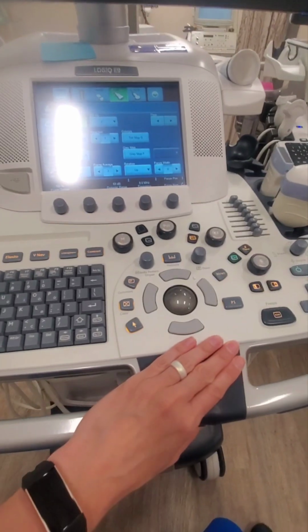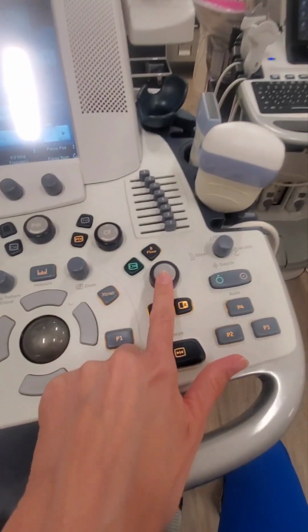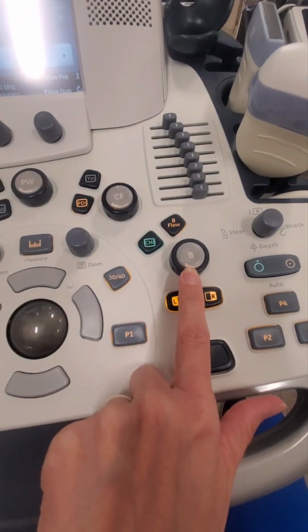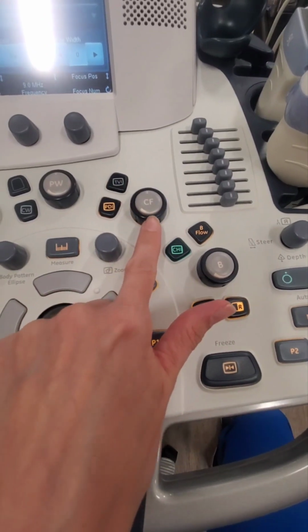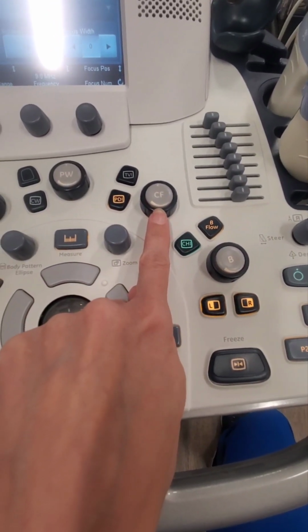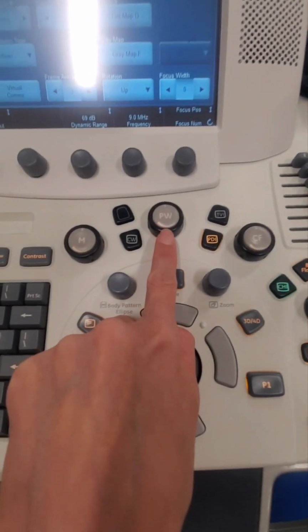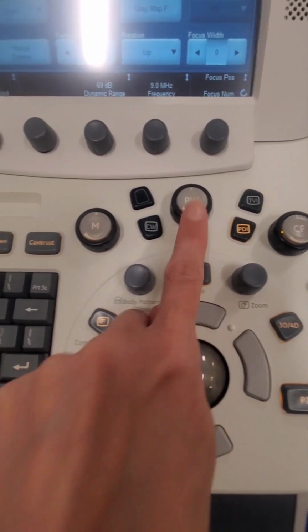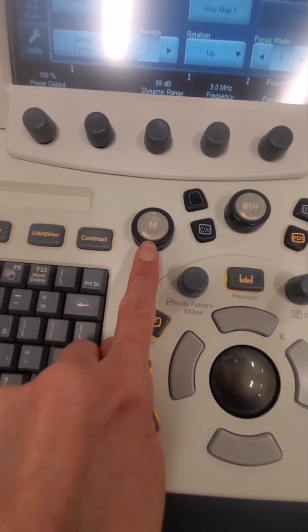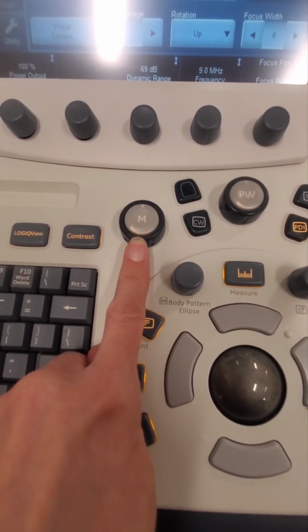All right, so we scan in different modalities. We have our B mode. This is our basic grayscale. We have color flow, which is a Doppler technology. It's a scanning modality. We have pulse wave, which is another Doppler technology. It does spectral. We have M mode, which is really good for motion. I'm going to demonstrate these for you as well.